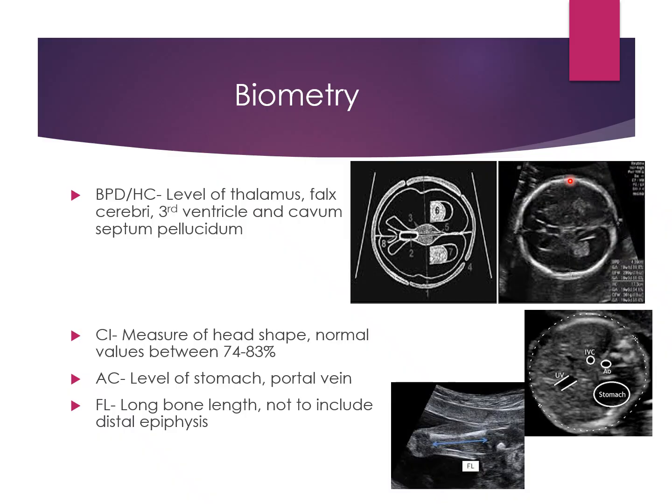So we are going to take the biparietal diameter at the outer to the inner on either side of the head, and then the head circumference is going to go on the outside only to include the bone. If we have any tissue here that we can see, we are not going to include it. So BPD is outer to inner, and the head circumference includes the brain and the skull, but not the tissue on the outside.